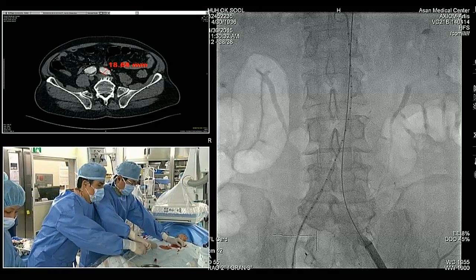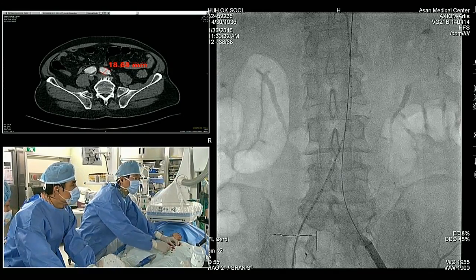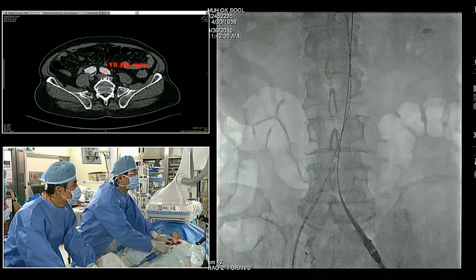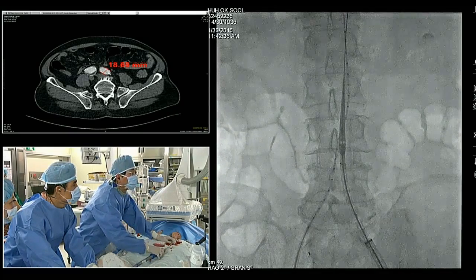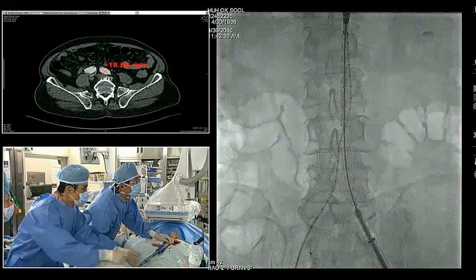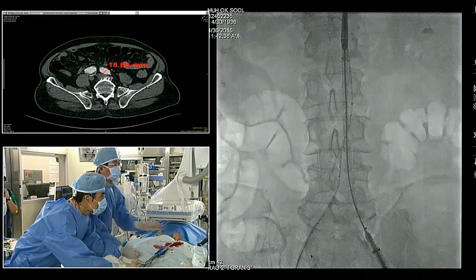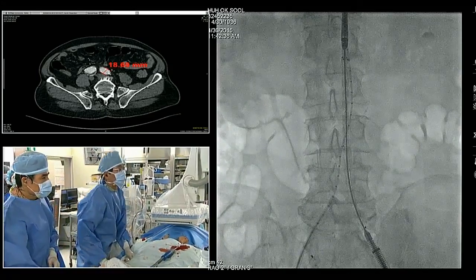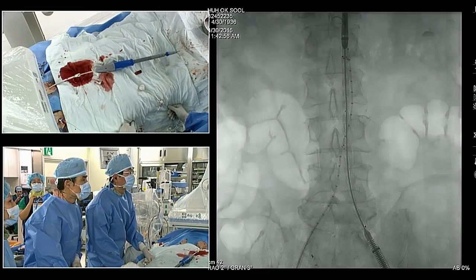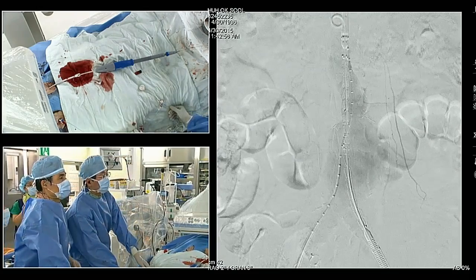As he's working here, it'll be very important to be cognizant of the distal common iliac bifurcation on the left and not to intentionally occlude the internal iliac, since he's embolized the right. I think it's reasonable in this case to go the route of embolization and extending the endograft beyond the internal on the right, given the patient's age and the fact that the internal iliac on the left side is normal. Most of these patients will have intermittent claudication for a brief period of time, but over a few months will have the return of pretty normal activity, especially in this age group.